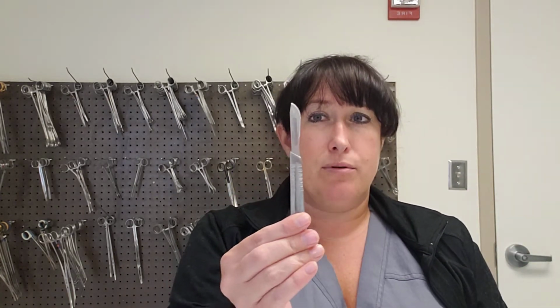So remember, I did say this comes in a long. We don't have it in the lab. And then it's got the biggest blade of all of them that goes with it. It's got the biggest thing here, and it's got the biggest blade. So yes, when you get into clinical, your preceptors are going to expect you to be able to just recognize this stuff. So if you're really struggling with keeping things separate because your eye hasn't been trained to that yet, work on it. Number 4, pretty big knife.